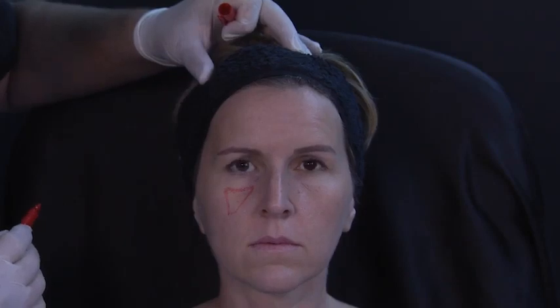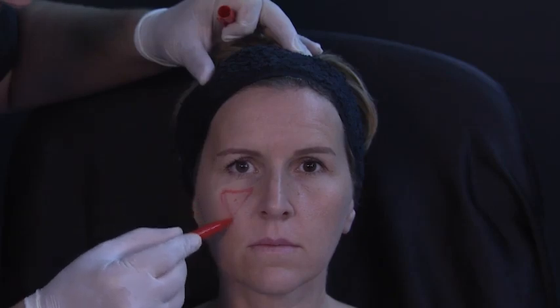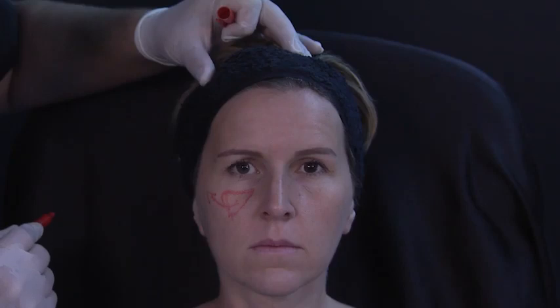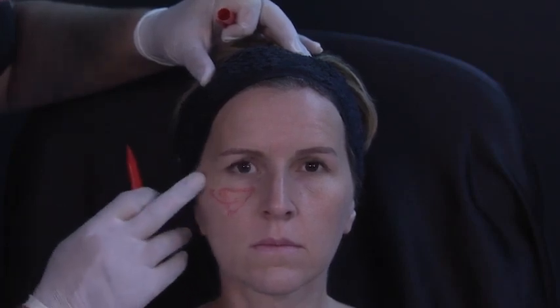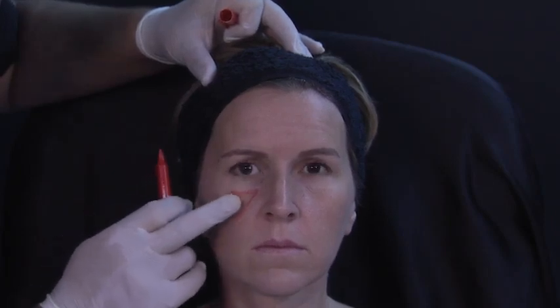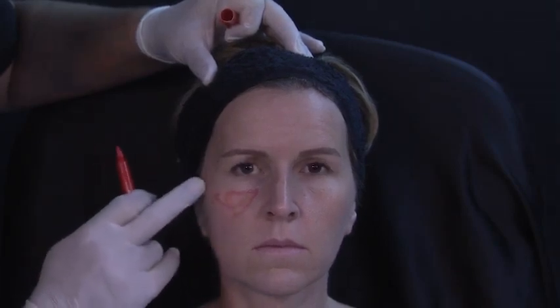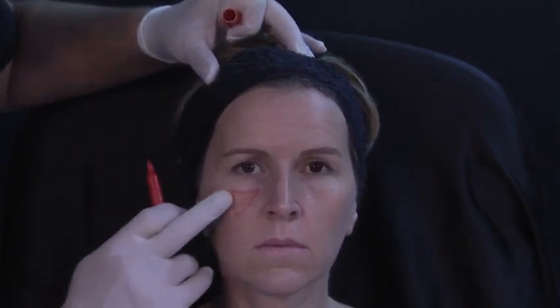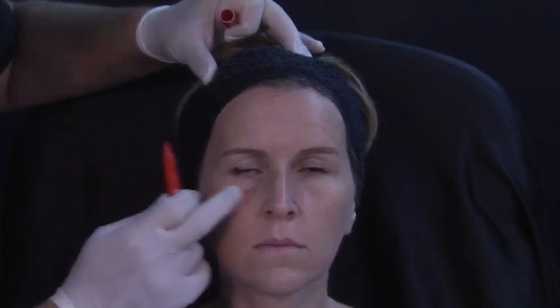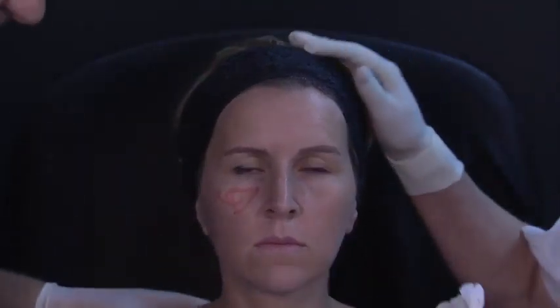My sequence of treatment when volumization is the priority: I'm going to start in this area. If I need more product or the patient has more budget, then I go lateral. This is the opposite of people treating all the time from the lateral cheekbone. If I start treating the lateral cheekbone, this will look more sunken. And this is something that Frank is going to show us now with the holotome, with the bone structure of this area, the zygoma and zygomatic arch, and how this malar area is the priority to volumize. So Frank, let's go with the holotome.